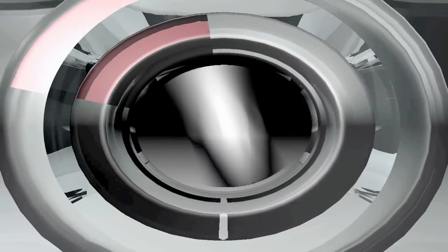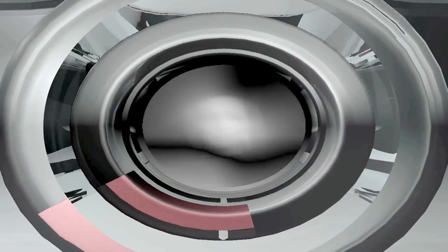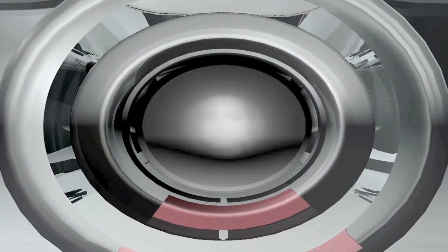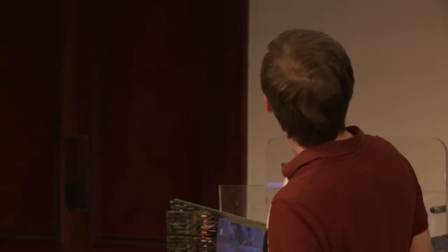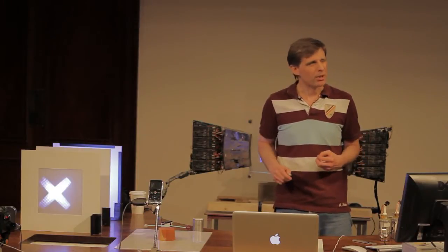So we'll add together all these beams as we go. Let's beam them back again, adding them together as we go. And hopefully we start to see some kind of pattern emerging that gives us the celebrity that's sitting inside our stick of rock. But it's not very good.